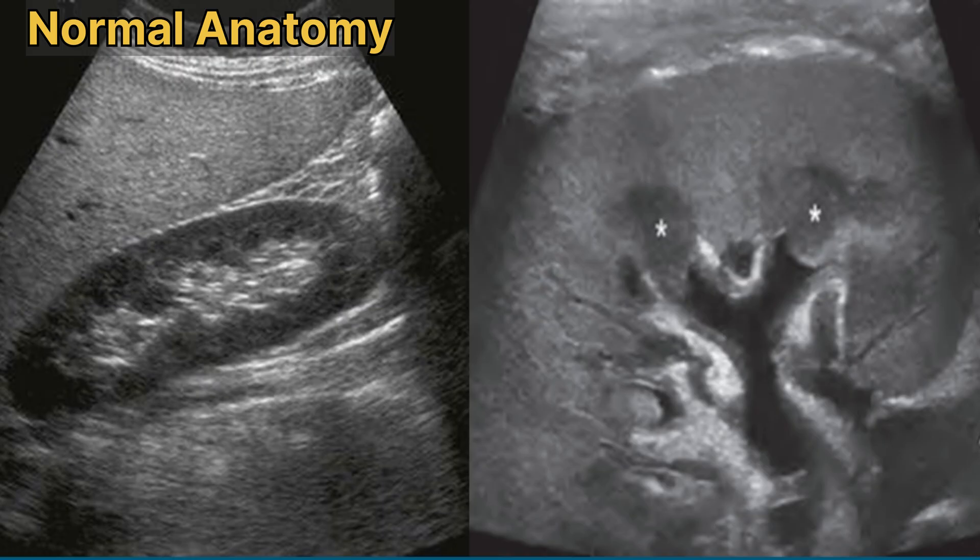In the adult, the average length of the kidney is approximately 10.5 to 11 cm, with a lower limit of about 9 cm and an upper limit of about 13 cm.